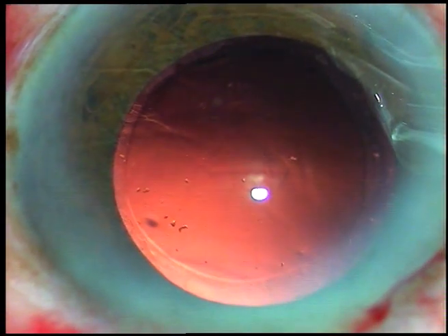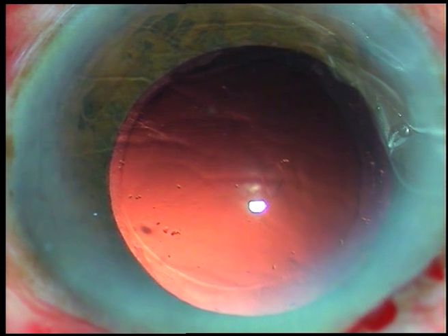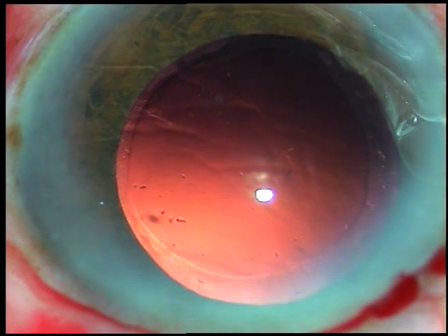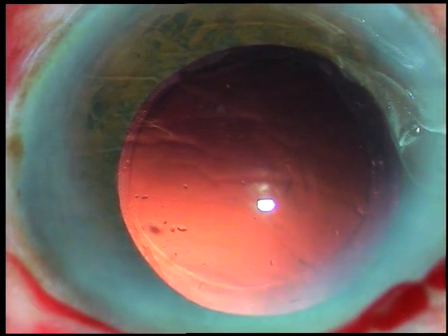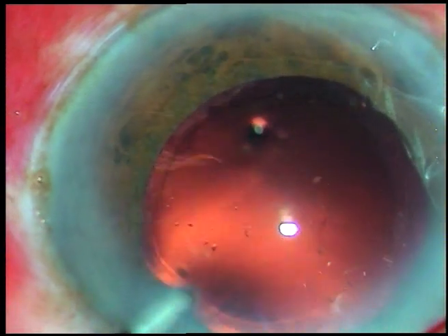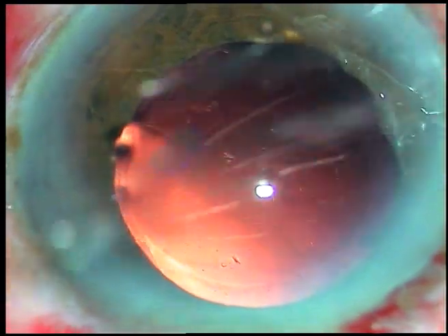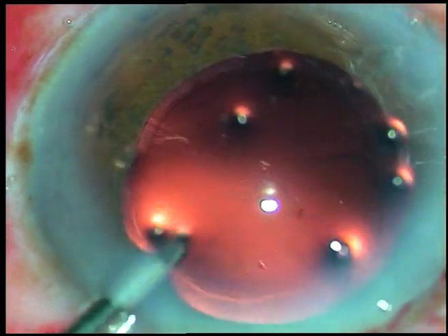And here I can see a small rent. My strategy now is to place the lens in such a way that this rent should not extend. I want to place the lens over the iris first in the anterior chamber, so I enlarge the incision a little bit and make it about 3 mm — the initial incision was 2.8 mm.